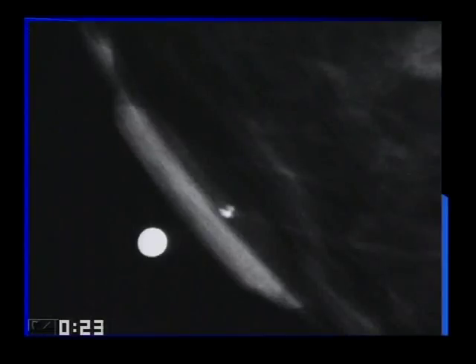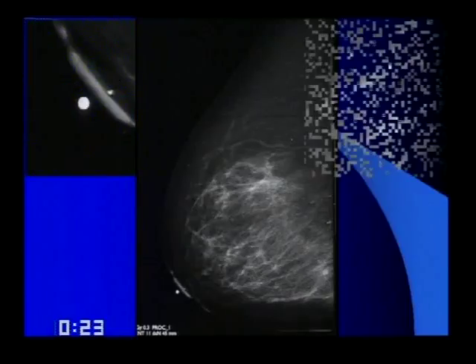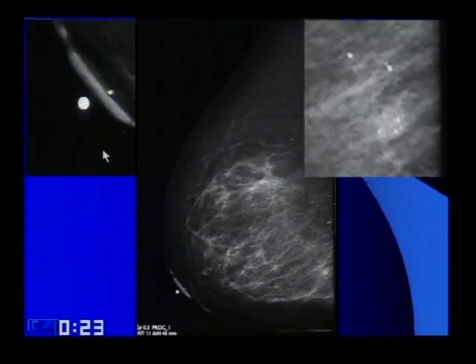They didn't layer. She does have a lot of benign calcifications, as you pointed out, but these were not benign. These were actually biopsied, and those were invasive cancer. The area around the nipple right here, you were correct in saying that you do a skin punch biopsy, and you get the pagetoid cells, which are big nuclei. So here is the MLO view. Again, here's the nipple, and here's this cancer, which is right back here.